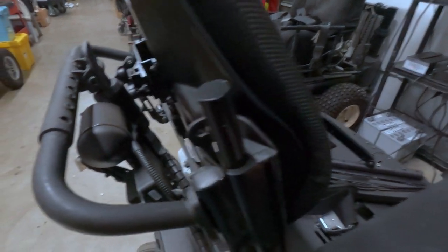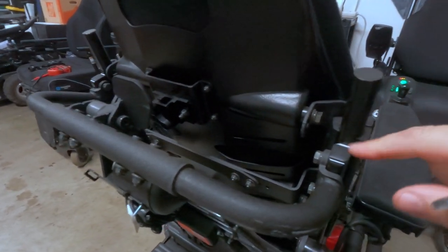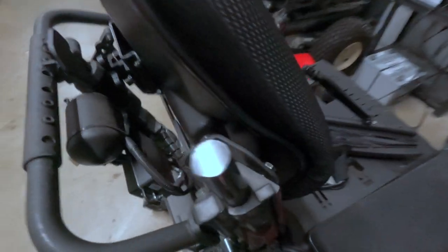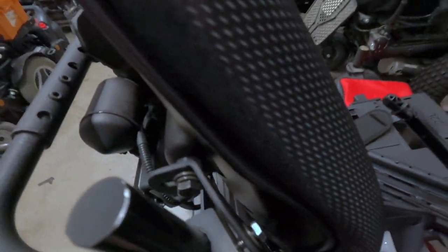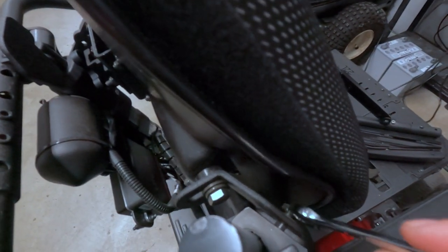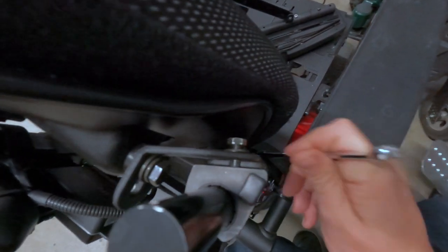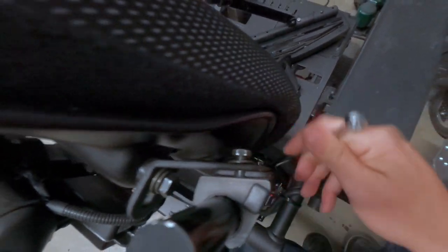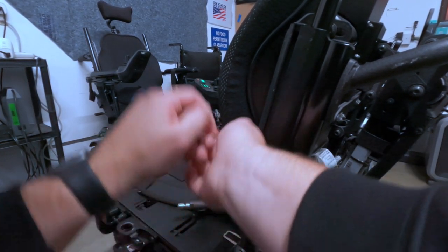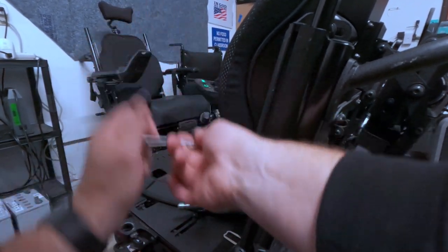This is very much an exploratory experiment. I need to get this backrest off before we can do anything else. I started going at these bolts here but they're kind of annoying to get to. Then I realized right here we've got a mounting plate, so if we remove these, the entire seat back with all the mounting hardware should come right off of here. Let's give that a try.